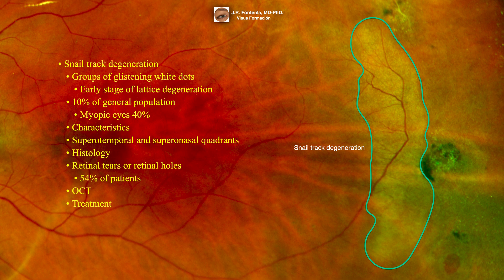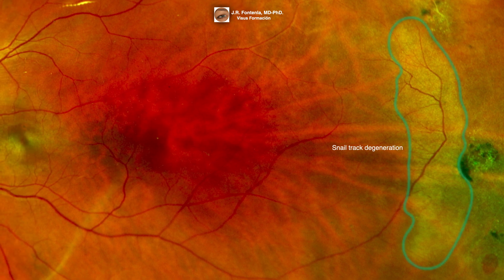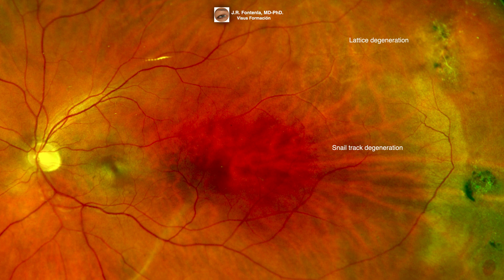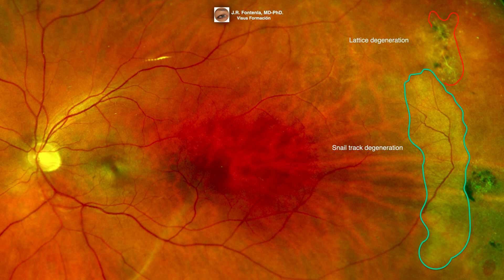Prophylactic laser treatment should be recommended in patients with vitreous traction or retinal tears associated with flashes and floaters. In this clinical case, the relationship of proximity and continuity of the lesions of lattice degeneration and snail track degeneration reinforces the theory that snail track degeneration would be an early stage of lattice degeneration.